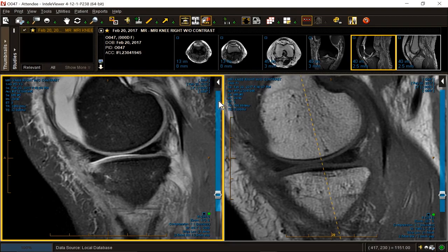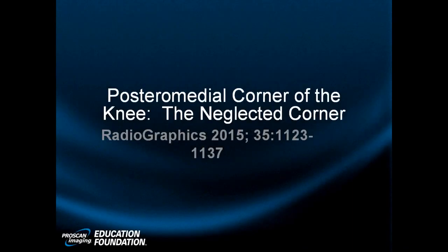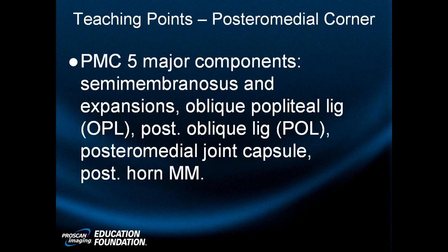Let's talk about the posteromedial corner for a minute. There's a beautiful paper written on this in Radiographics in 2015. So the posteromedial corner is the neglected corner, and when it is neglected, we discussed how it can lead to stress on other structures, specifically the posteromedial meniscus. If you've got a PCL tear and you miss a posteromedial corner injury, you have probably deprived the patient of a surgery that they need.